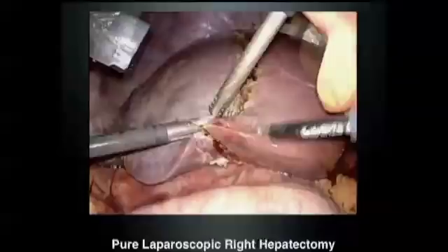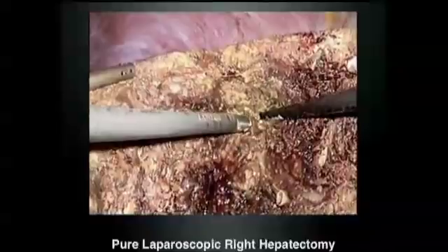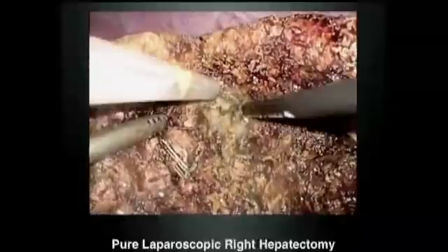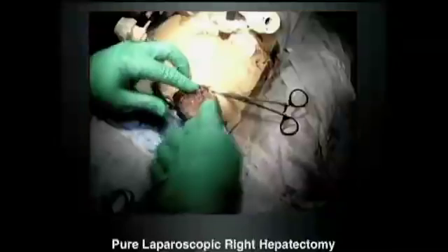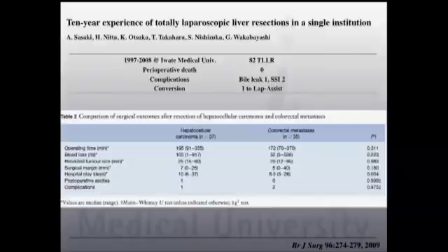Then we start parenchyma transection. The ultrasonic suction is used along with monopolar coagulator by the first assistant. The operator uses clip and scissors and ultrasonic dissector — forehand surgery. Finally, we apply a stapler to close the vein, the caudate ligament, and the root of the right hepatic vein. The right side of the liver is retrieved from a suprapubic incision. We reported from 1997 to 2008 having done 82 total laparoscopic liver resections, with no perioperative deaths, only complications of bile leak and surgical site infection, and one conversion to lap-assisted.